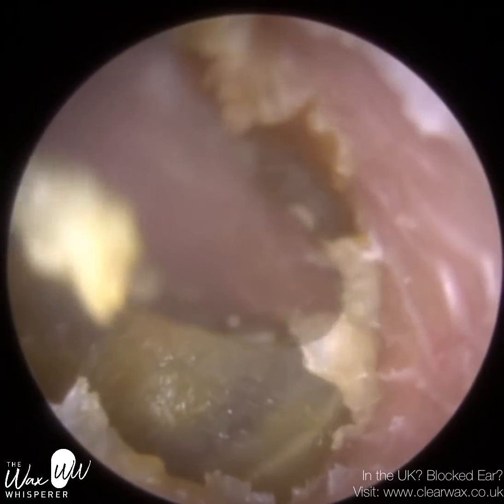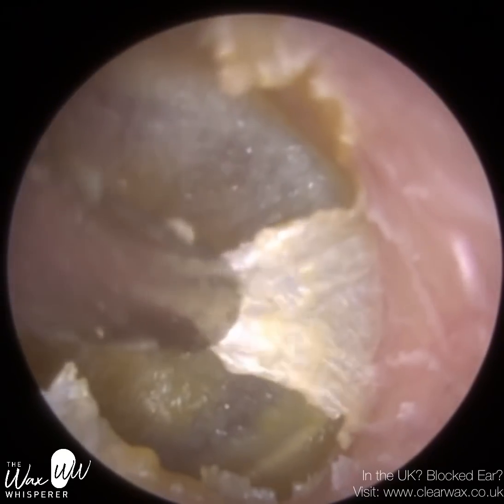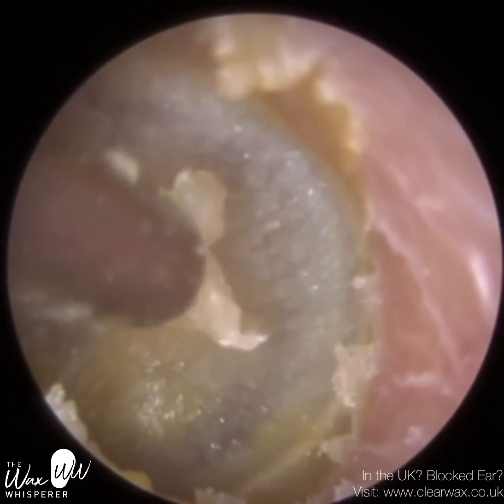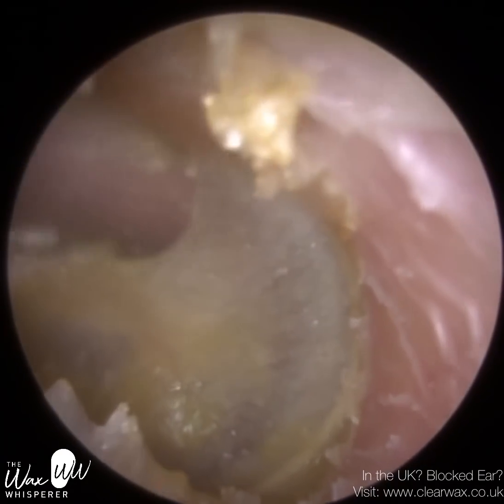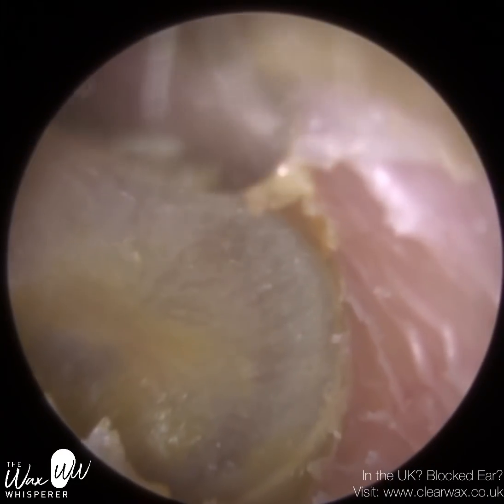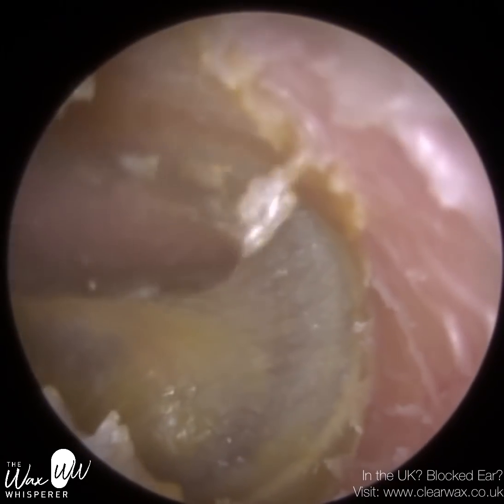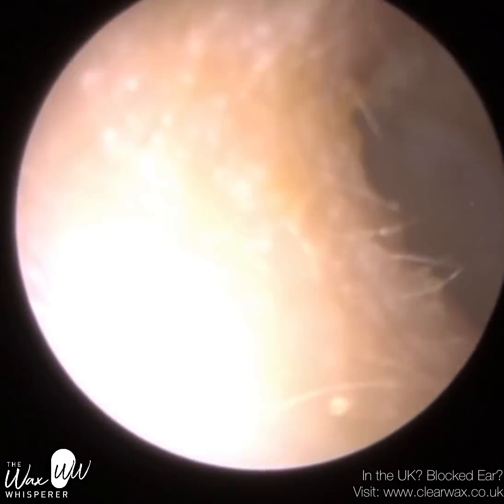Just right at the bottom and really close to the eardrum. So we're going to be really careful. Now, because this patient is prone to having ear infections, I'm trying to get as much skin out as possible, without making it uncomfortable for the patient. The more skin I get, the better, because this skin's not going to migrate by itself. It's just going to die and shed, and become damp and then infected.